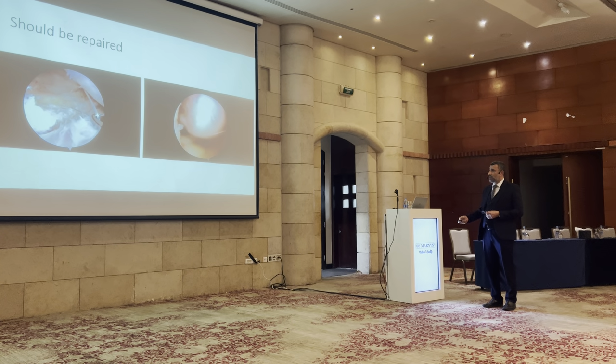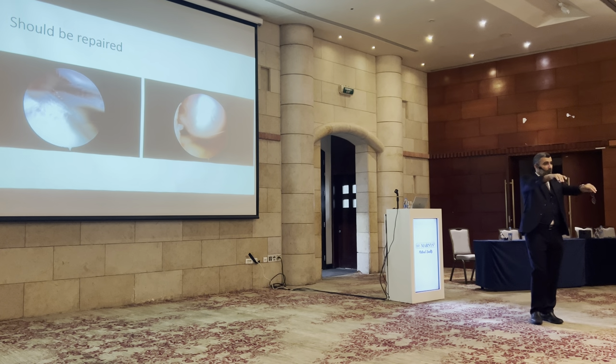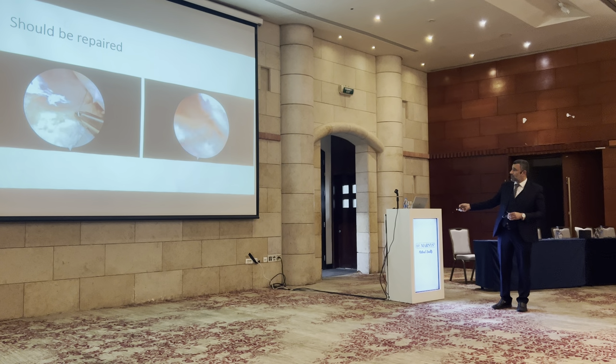What we do also, again, at the posterior lateral border, we pass the sutures. And again, we check alignment of the meniscus. Like in rotator cuff, you have to keep it aligned, not under improper tension. After we check the alignment, we pass the sutures.